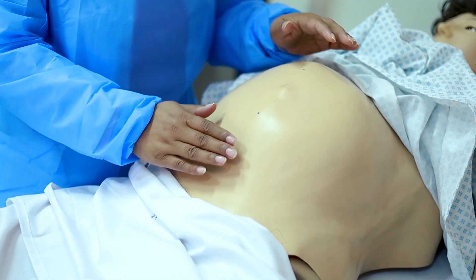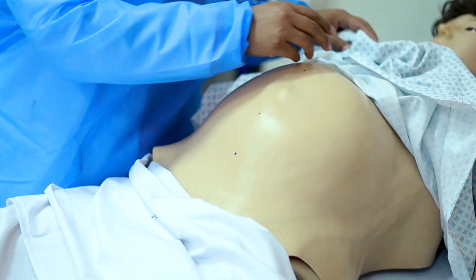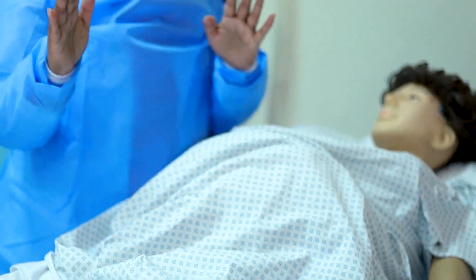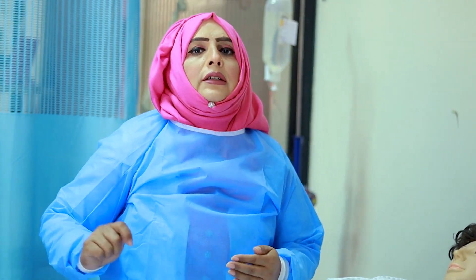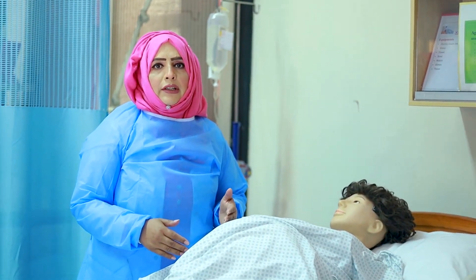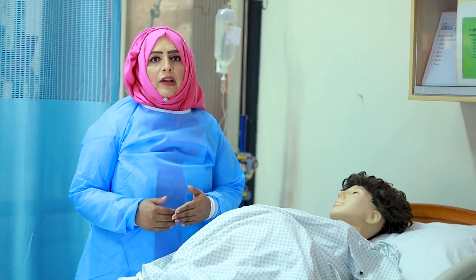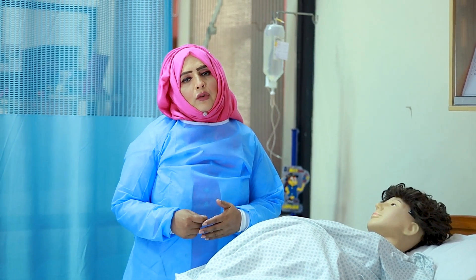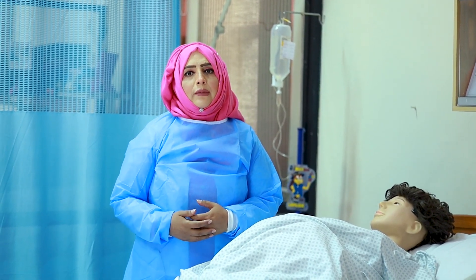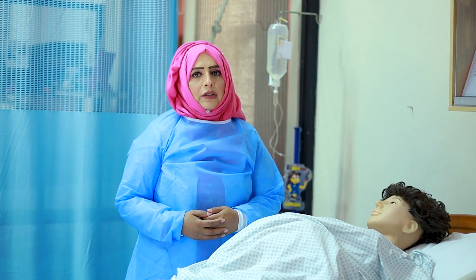We have now completed our examination. Don't forget to perform hand hygiene again and document the procedure — document the fundal height you measured. We have measured that Miss Shazia is having 36 weeks of pregnancy. I am going to add the date, time, and measurement on the patient chart.